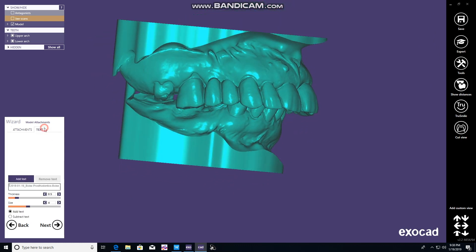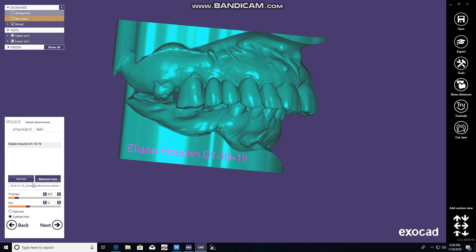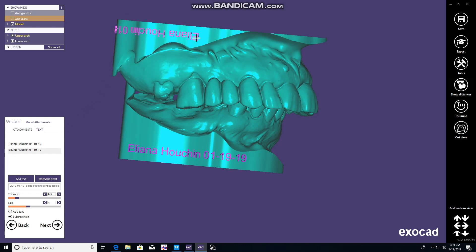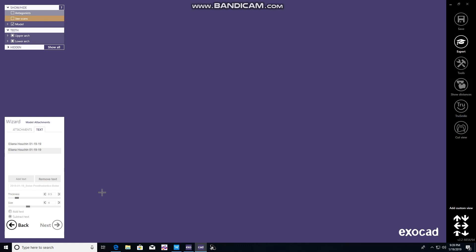You go to text. One limitation is you have to retype it every time, so I just type the patient's name and last name, and the date we obtained the scan. I'll highlight it, copy it, and then hit subtract text. Hit add text and put it on the model where I want. Now to do the maxillary one, we'll right-click, paste, and add the text, placing it where we want. Now all we need to do is push next. It'll think again and make a negative imprint of the patient's name on the models. Now you are done.